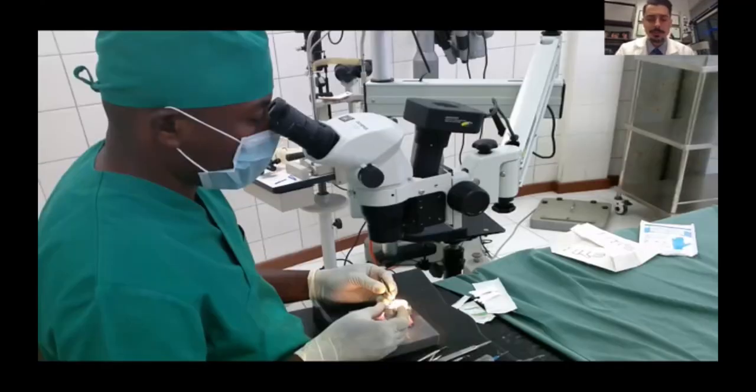So this was the actual picture of our wet lab. One of the things with the animal globe, in terms of securing the eye, is that they do make very nice foam models, which frankly are likely not that expensive. I didn't have those at the time of this photo, so we just created, using simple foam packaging, a hole cut out, a place to essentially place the globe and pin it down. That's what you're seeing here: very simple foam inserts that we cut a hole into, so that the globe could then be secured.